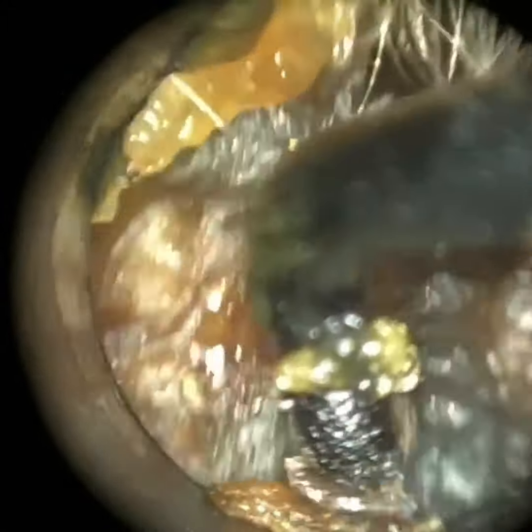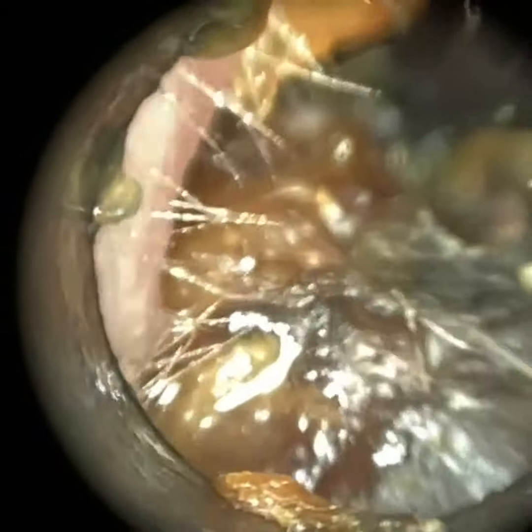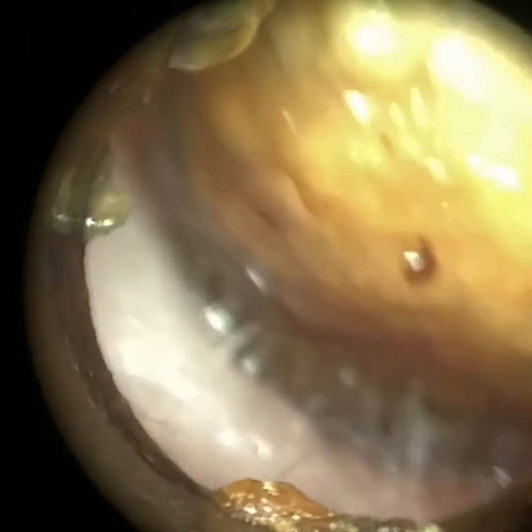Generally with children I try to avoid using manual instruments because they can get a bit frightened by the look of it, and it's just a bit more tricky. Managed to prise that away. The less time we spend in this child's ear the better because, again, he was very anxious. So there is a bit of skin at the floor of the ear canal here.